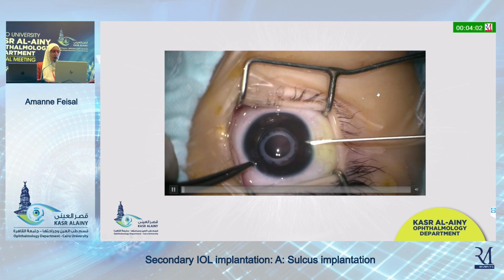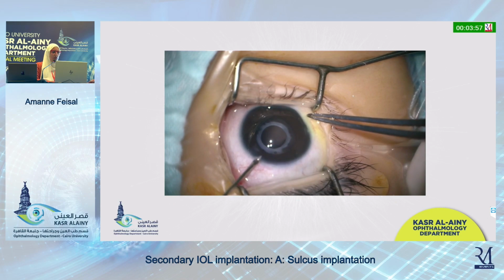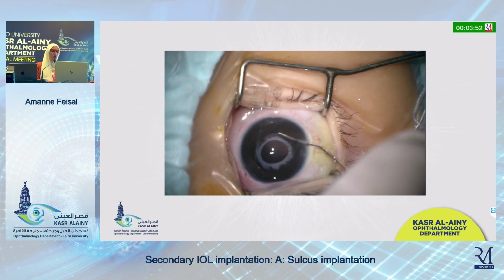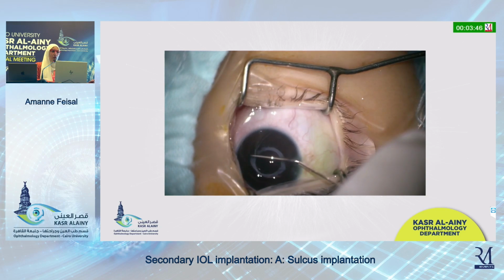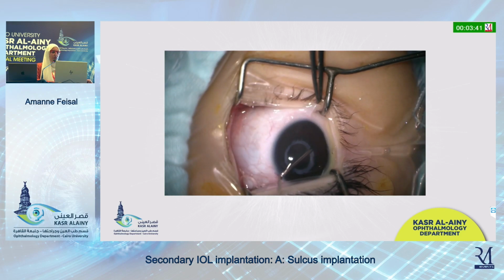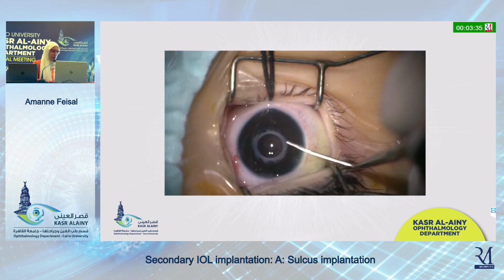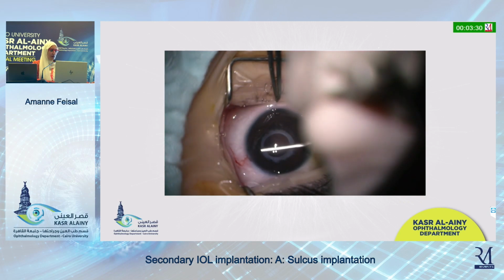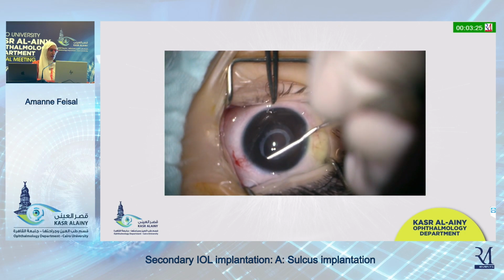Here she starts by opening her side ports first and reforms the anterior chamber with viscoelastic and makes sure that her sulcus is patent. She is injecting viscoelastic in the sulcus right now, and then she will introduce her iris spatula to cut a posterior synechia at around 7 o'clock in the video in front of you. And there she goes in the sulcus to make sure that there aren't other hidden adhesions between the iris and the capsule. There you go, it snaps.